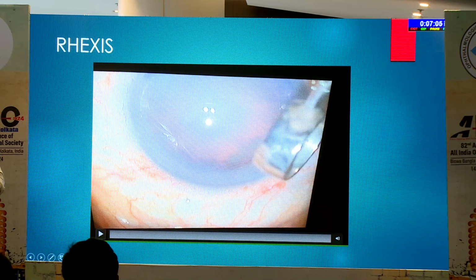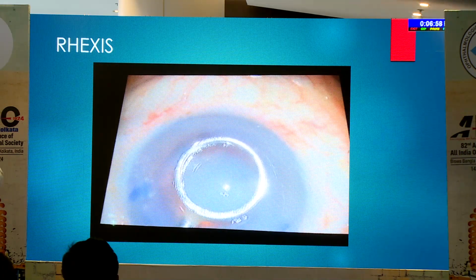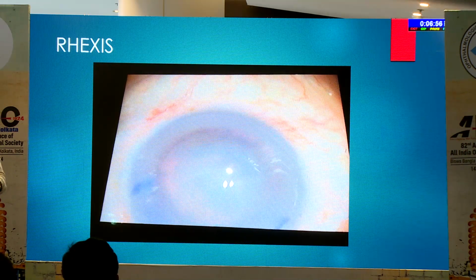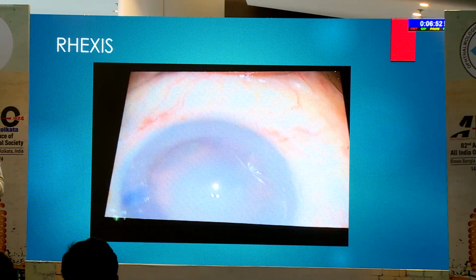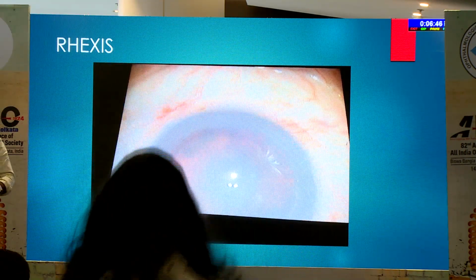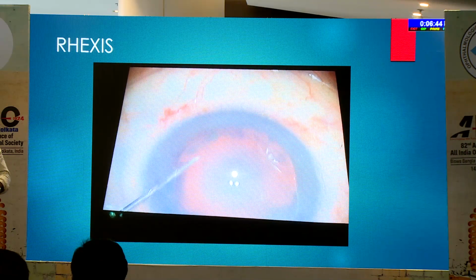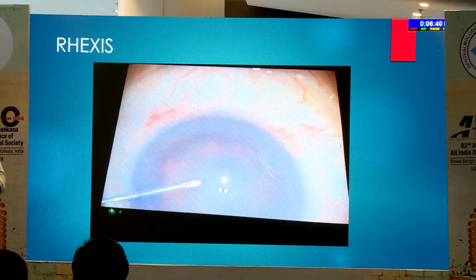Now going on to the rhexis, again it's a good idea to not hold the conjunctiva. You can use a rhexis marker. If you are one of those privileged ones, you can use the Verion system. Okay, so once you mark, you can go in through the side port with the, it is your choice whether you want a rhexis needle or you want a Utrata forceps. But whatever it is, a few tips I will tell you.